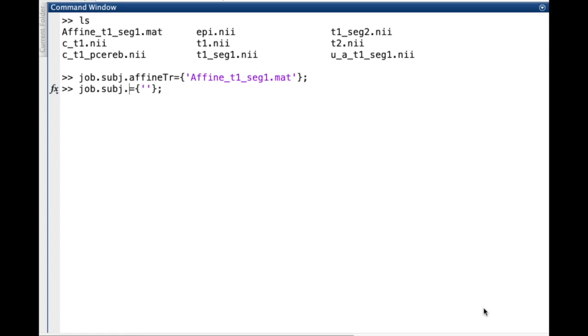And then we will include the images we want to reslice using the field resample. This function can receive several images in this field, so we can apply the same deformation to several functional images in the same line of code. We just need to separate the names using a comma. For this example, we will use only one.